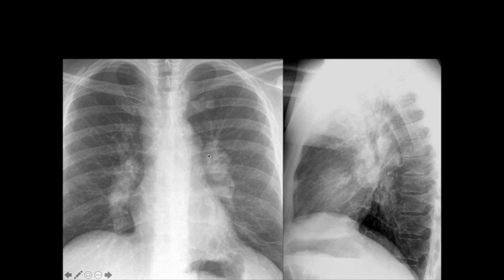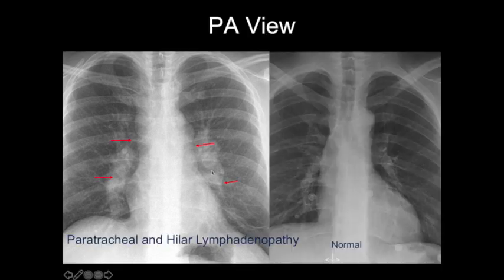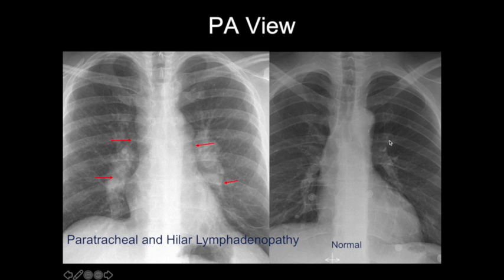So in this case, based on what we've seen, we're calling mediastinal and hilar adenopathy bilaterally. If you're still confused, have a look at our normal case here. Look at the normal contours of the mediastinum. Our AP window is usually concave — it's convex here.